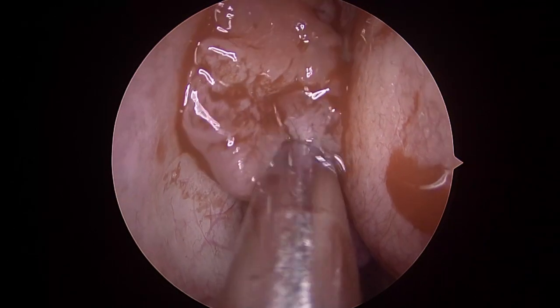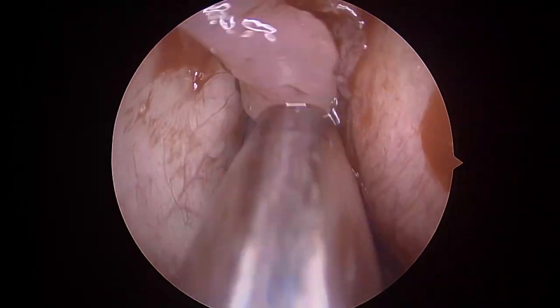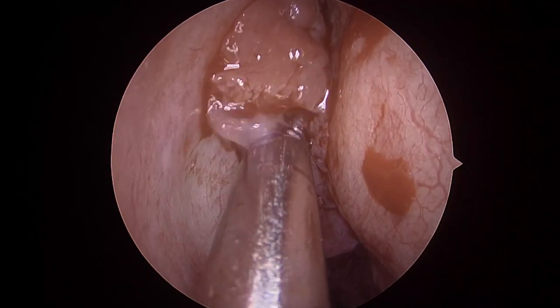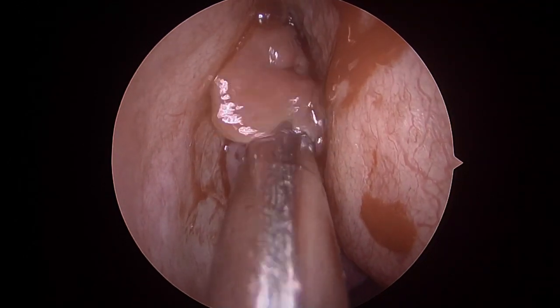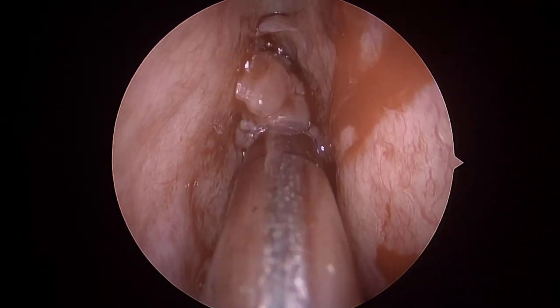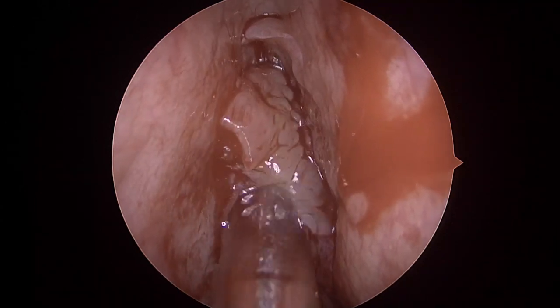So, the most important landmark in FESS is the middle turbinate. And so, you debride the tissues slowly and try to find your middle turbinate or define the middle turbinate if it has become polypoidal. So, slowly from inferior to superior, I'm clearing all the polyps. And as I reach the olfactory cleft, I carefully, slowly debride the polyps.